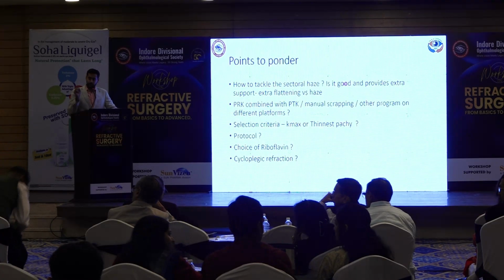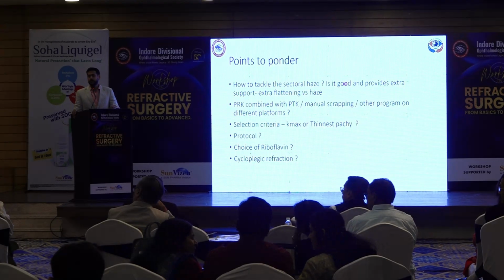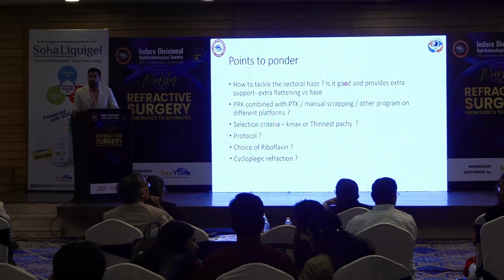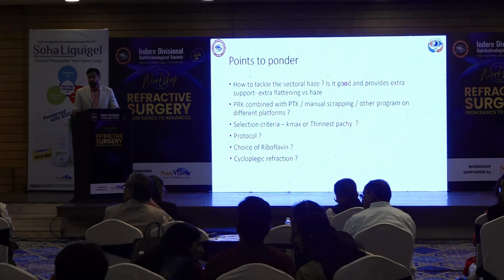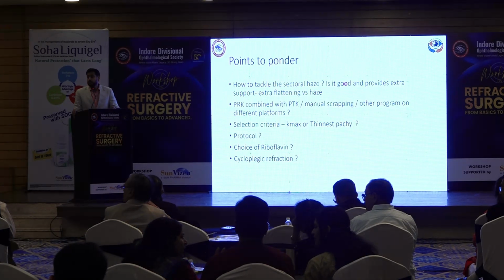Thinnest pachy or highest Kmax, which will you take? See, thinnest pachy was a question once, but I think Shruti can give you, we have a calculator. I have done it at close to 290 microns. Not that I advise it, but I have done it. Farhad Hafizi has done it at 240. That calculator tells you how much time to use, and I think it can be shared by Natasha also. Use this, it will be very good. Don't worry about thinnest pachy now because we have the thin calculator.